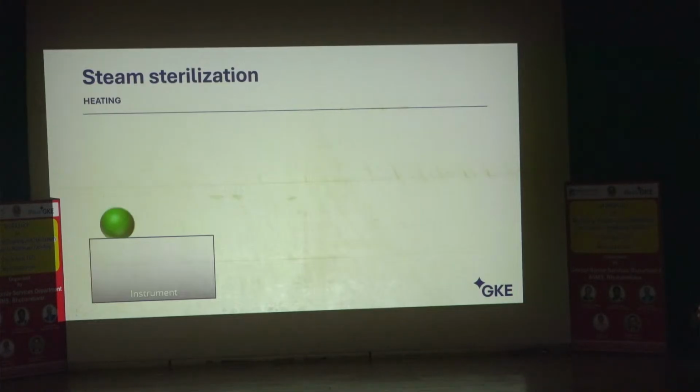Now it will touch the surface of the instrument, and it will create 1 drop of condensate, and the very process of condensation will transfer 1 specific amount of heat energy into the instrument.